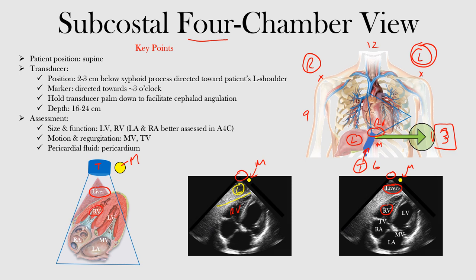We're also getting to see the left ventricle — the LV is visible here. We have the atria as well: the right atrium is here in this image, and the left atrium is pretty much the most posterior or lower portion of this image. We can also see the valves: between the left atrium and left ventricle we have the mitral valve, and between the right atrium and right ventricle we have the tricuspid valve. So we can see all four chambers and both valves.